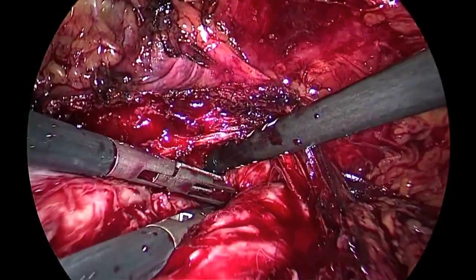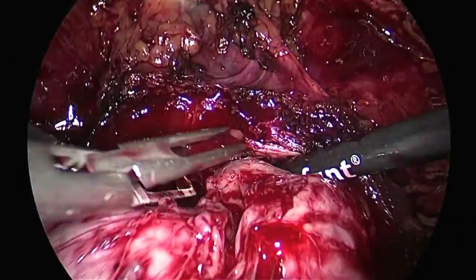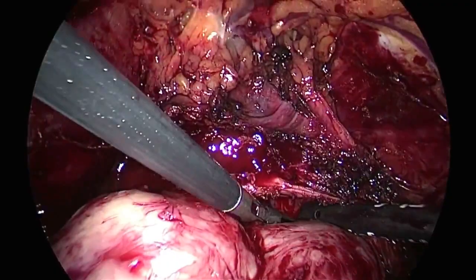Okay. Francesco? Yes. If you have a median lobe, do you change the technique? No. I think that dissection must be the retrograde way, as you can see, because at the end, I perform an incision of the bladder neck. It's clear?